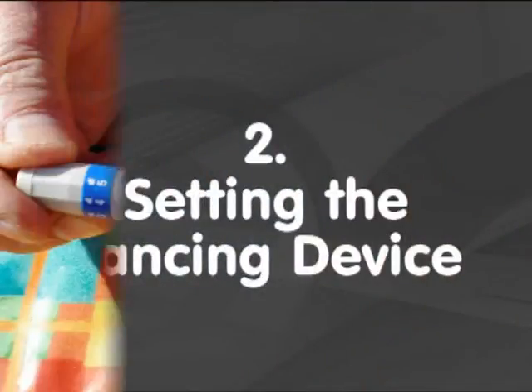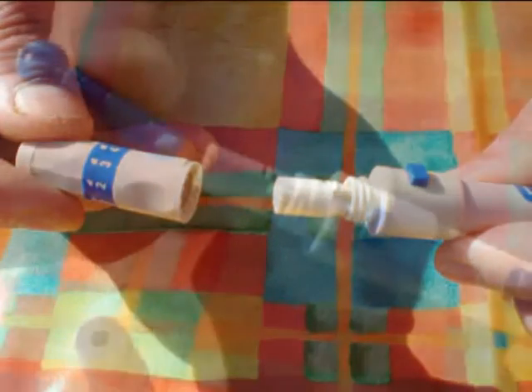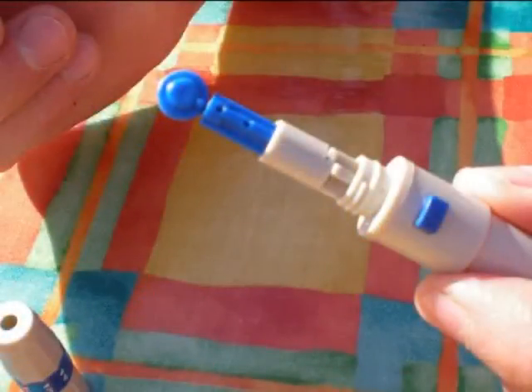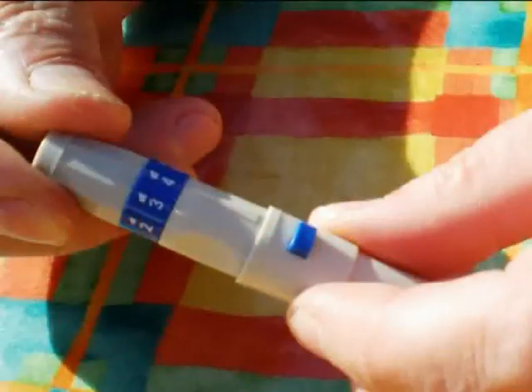Next, you need to set the lancing device. This is very simple. First, you unscrew the top cap and insert the blue lancing capsule by holding onto the top part of the lancing device and pushing until the capsule is fully engaged. Then hold onto the capsule and spin the protective cover at the top to remove it. Screw the top cap back on and then choose the depth of penetration you require.